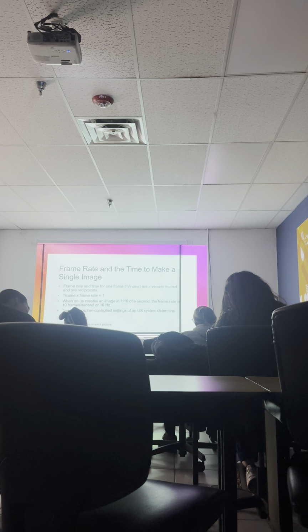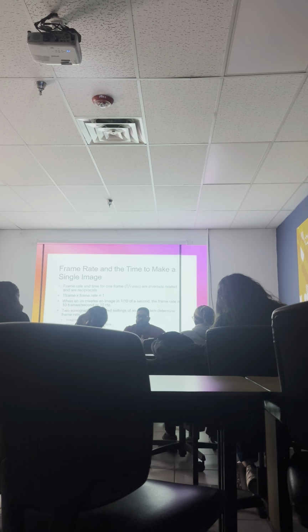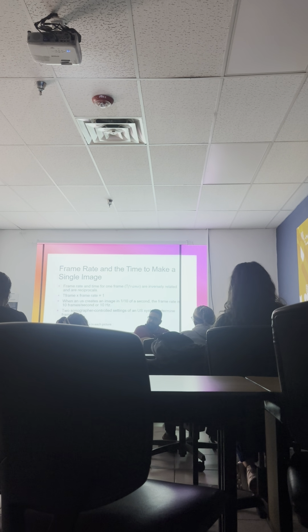Wait, what are the two that are directly related? T frame and depth. Okay, so if we're traveling 5 centimeters, it's going to take longer to make that one frame, as opposed to traveling 1 centimeter, which takes a shorter time to make that one frame, right?